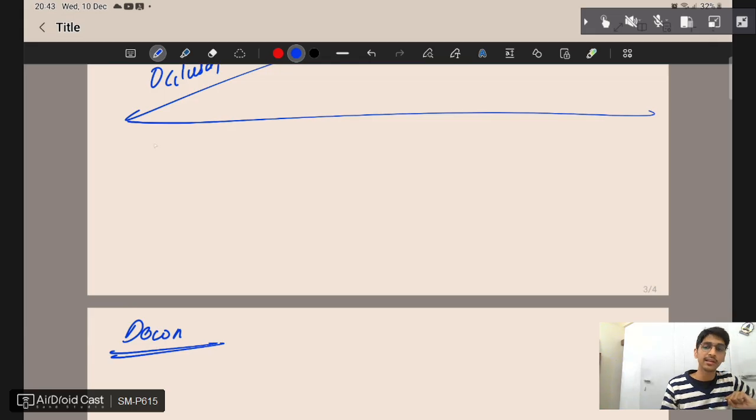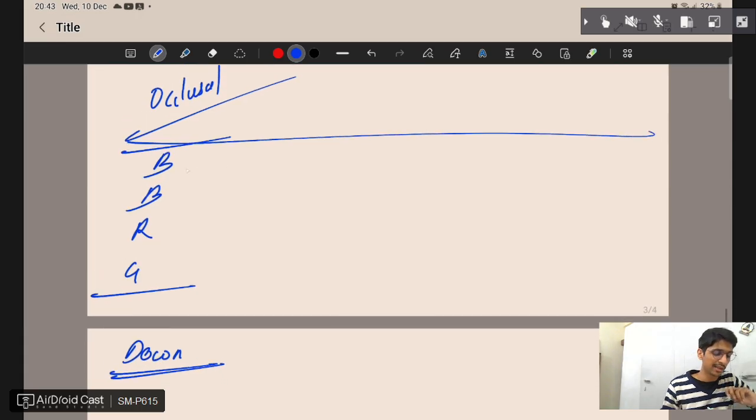While doing orthodontic treatment, there is a set of ceph tracings which we have to do in various different colors. The mnemonic is BB Raji. Before a girl comes into your life, your life is black. That means pre-treatment. Then suddenly your life has colors.